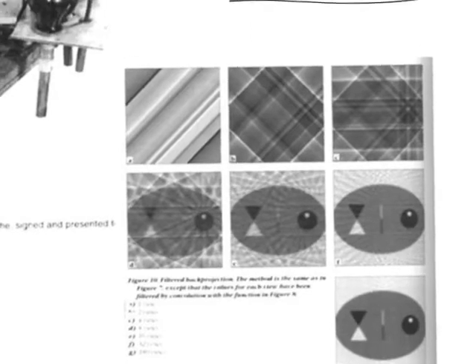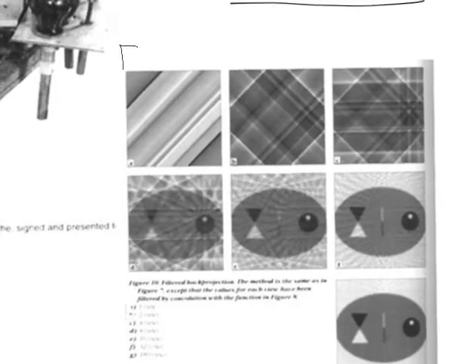So here's a great example of some raw data right here. We will call this a one projection, right? So this is just the cow brain, or in this case it looks like a bunch of circles and crap, but this is some stuff from a single projection. So it's raw data from a single direction. But we're not interested in that.